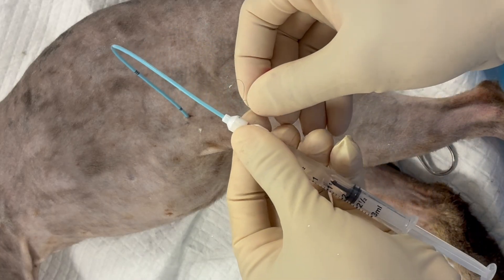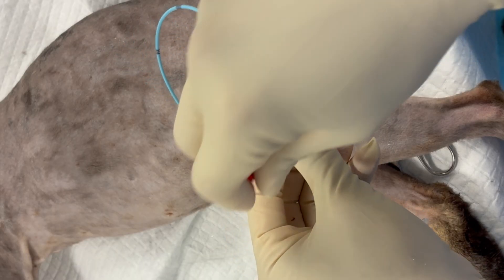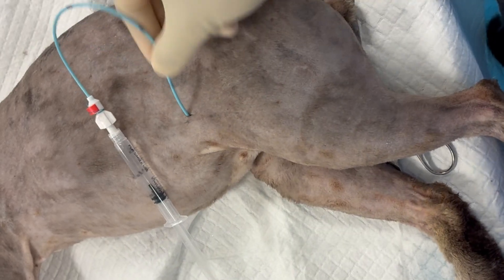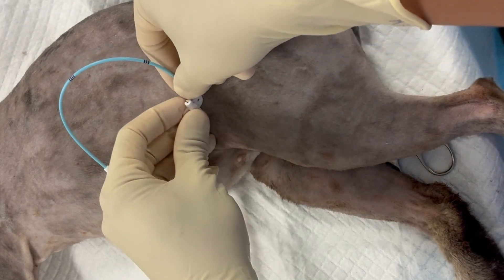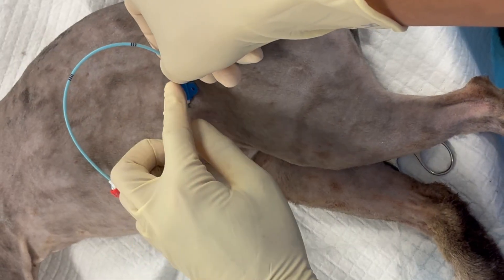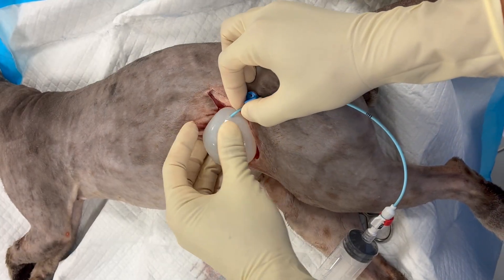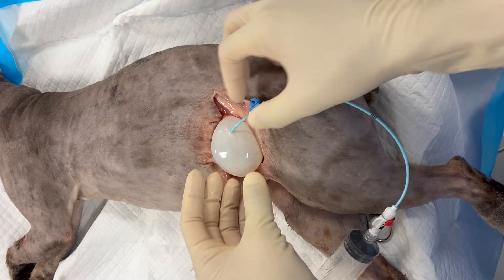Now, we're going to pull the locking string tight. That's going to create the loop within the lumen of the bladder. Then wrap that string around the hub and secure it with a clamp. You can see that the pigtail is not able to be removed. Then we're going to apply our catheter anchors and suture that to the skin. Here, I've dissected out the bladder to see what's going on internally — you can see the pigtail curled up and secured within the lumen.